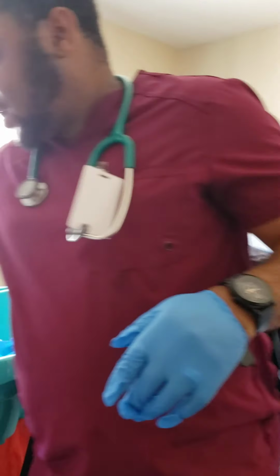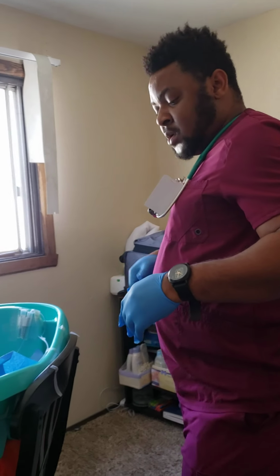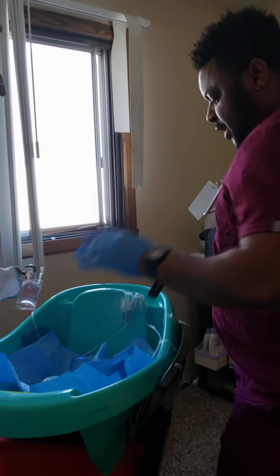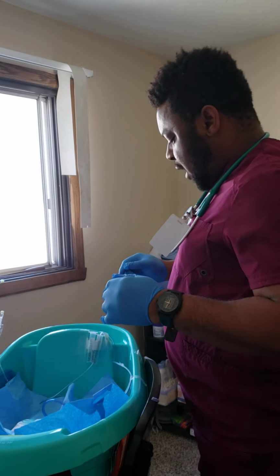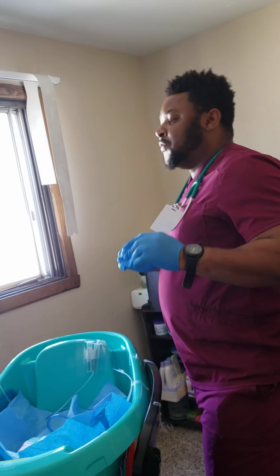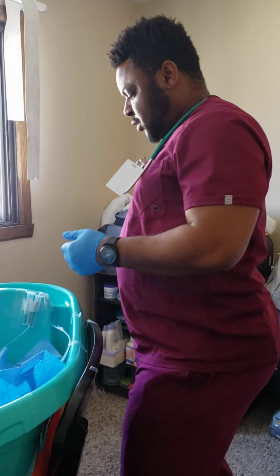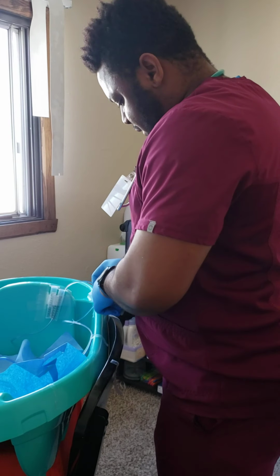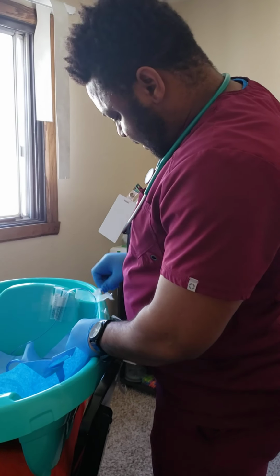Then when that has been done, I'll put my patient's paper towel closer to them. Then I'll tell them that with the count of 3, they will take in a deep breath and hold while I pull off the tube. So I'll go ahead and take out all the tapes. Take out all the tapes. Take out the tapes from the dress.